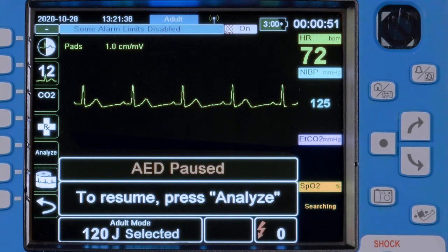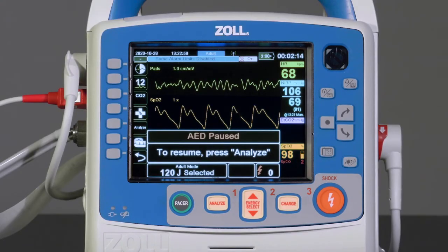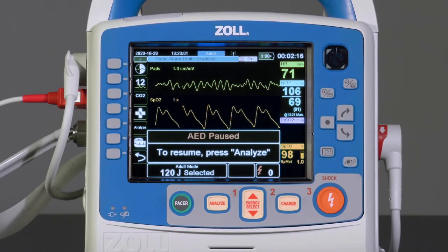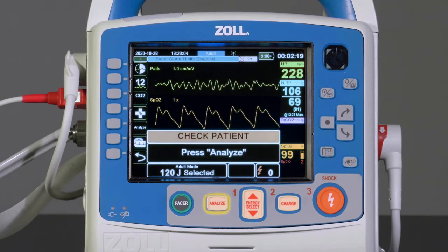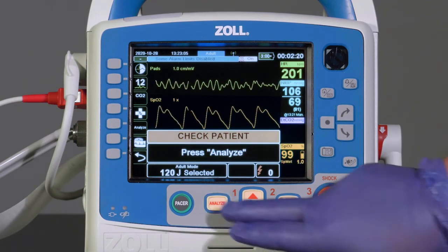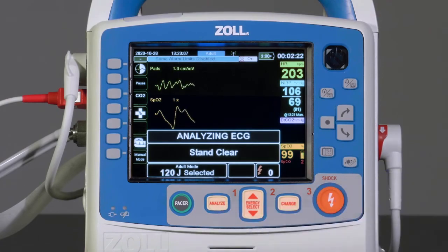If it detects a shockable rhythm, a Check Patient message with audible prompts will be provided. Select the Analyze button to restart the AED protocol. Stand Clear.